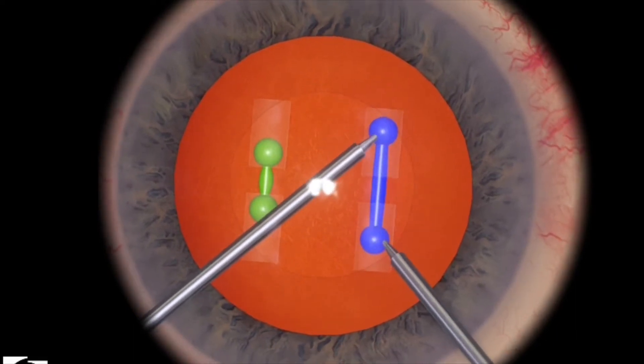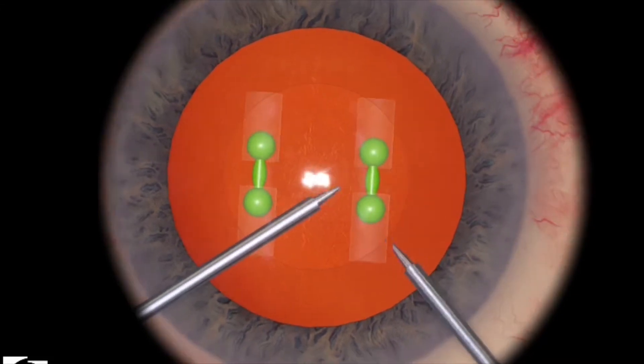So there you can tell that I accidentally let it slip, and so I've lost points for that.